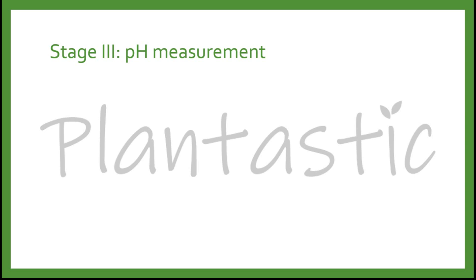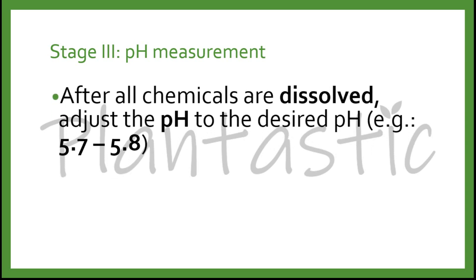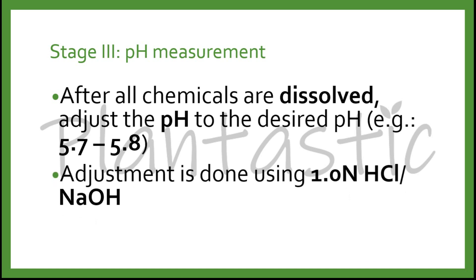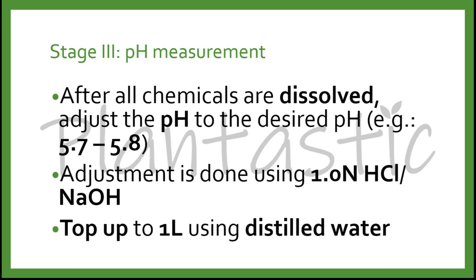After all the chemicals are dissolved, we adjust the pH to the desired level, which is commonly in the range of 5.7 to 5.8. The adjustment is done using 1.0 normality of hydrochloric acid (HCl) or sodium hydroxide (NaOH). Finally, after the adjustment is done, we top up to 1 liter using distilled water.